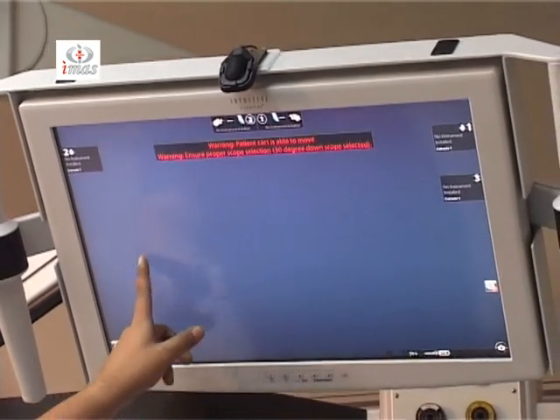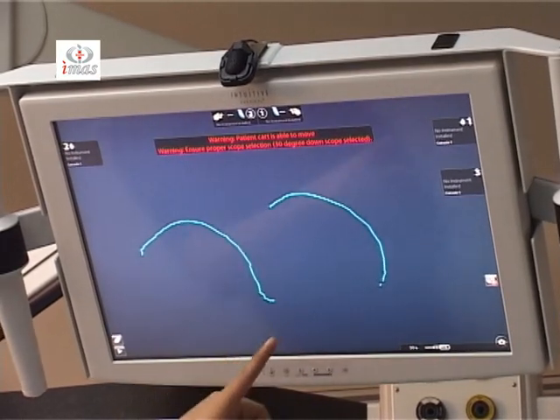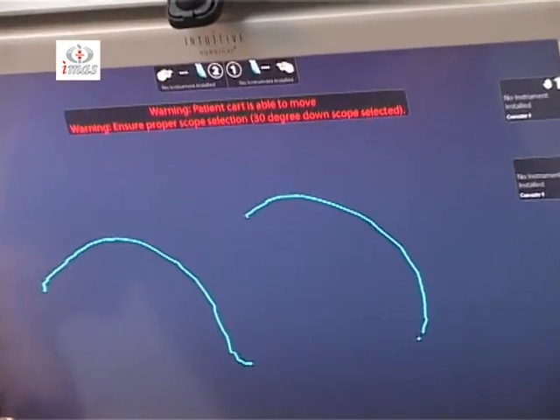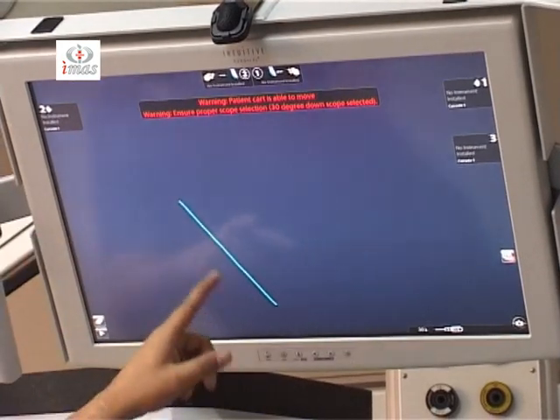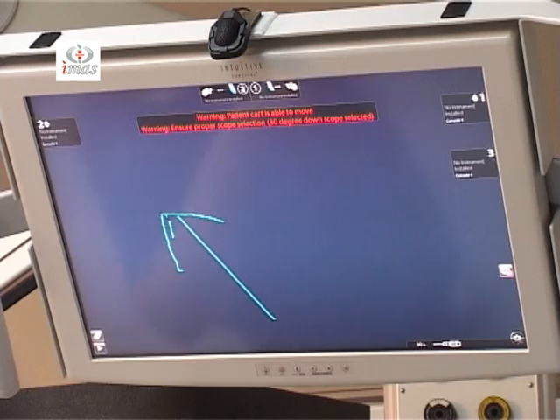And this also provides telestration. You can just mark on the screen and the surgeon will be able to see on the master console whatever the assistant wants to say, and it just goes off like this. So this is the telestration facility, and the assistant can point out some structure if he wants to during the surgery.